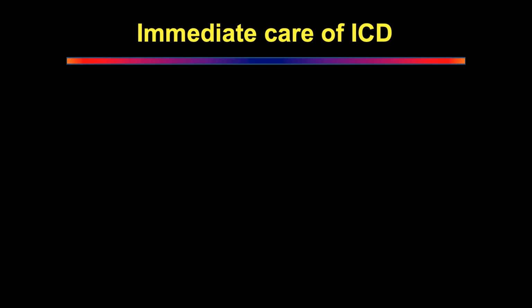You do go to -4 when you have got an aggressive leak which is not being controlled or the patient is getting rapid surgical emphysema. Then you increase the suction to allow the lung to come up. But usually you will end up putting in a second drain in that clinical situation. So -2 is a good answer to give. 2 kilopascals is the answer you have to give in an exam.